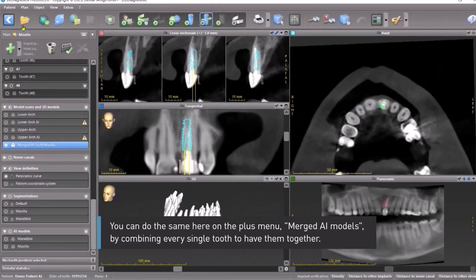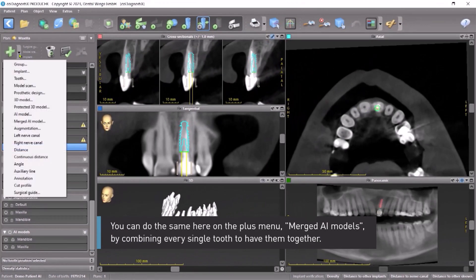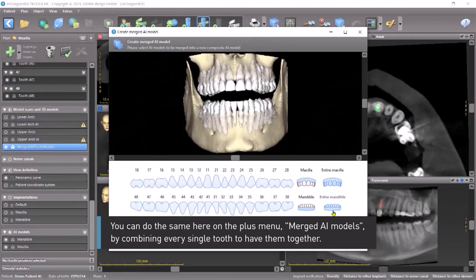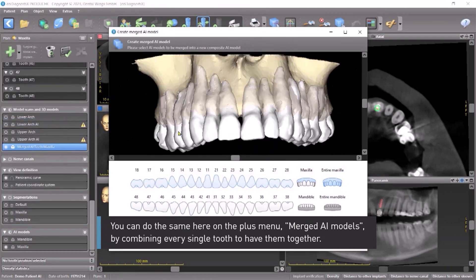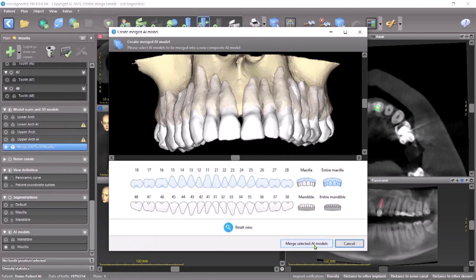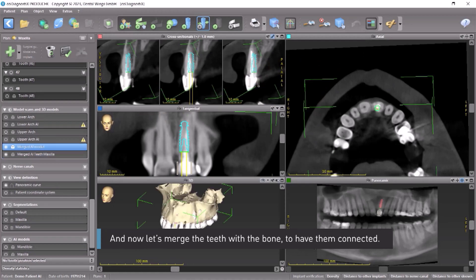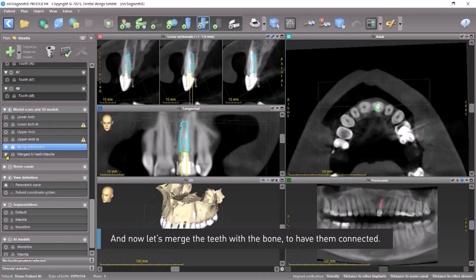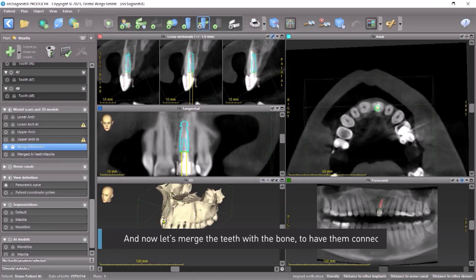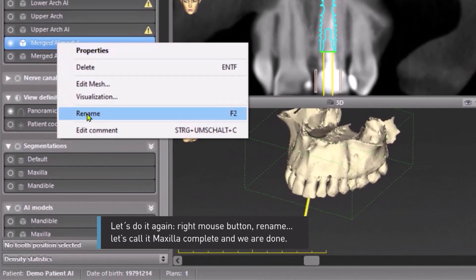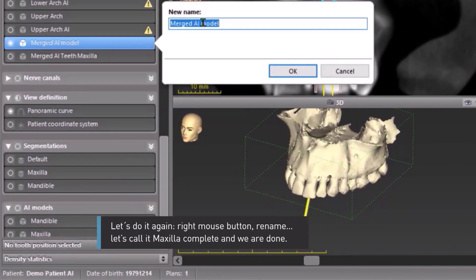You can do the same on the plus menu — Merged AI Models — by combining every single tooth to have them together. Now let's merge the teeth with the bone to have them connected. Right mouse button, rename. Let's call it Maxilla Complete, and we are done.